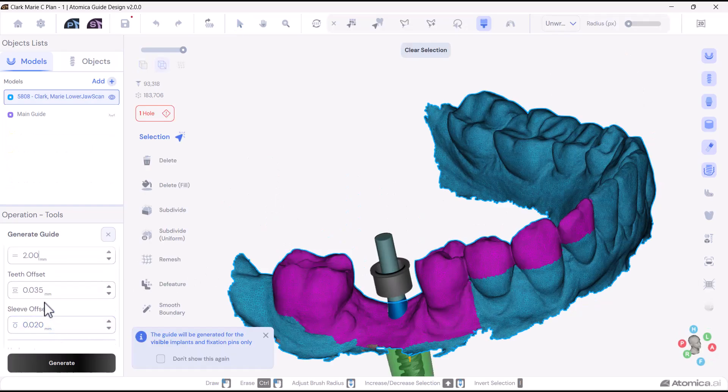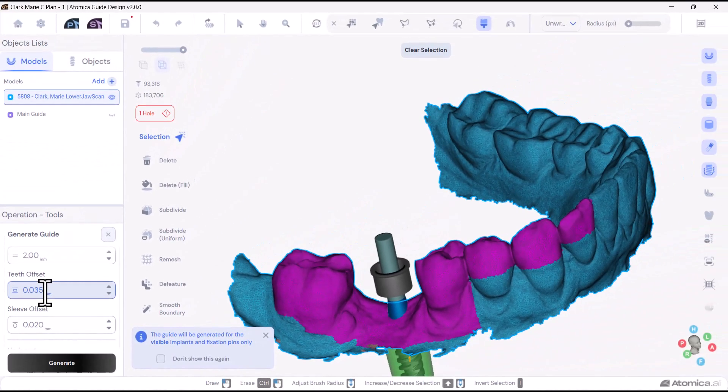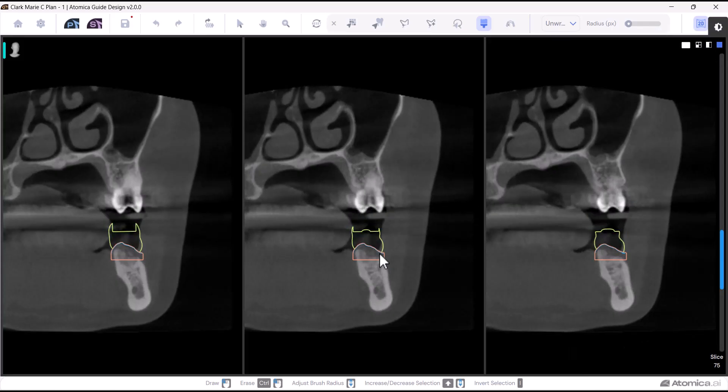Next is the teeth offset, which refers to the space between the guide and the teeth, affecting how tightly the guide fits. As mentioned earlier, the guide should not be too tight or too loose. This balance ensures the guide is stable and secure without causing discomfort or instability.